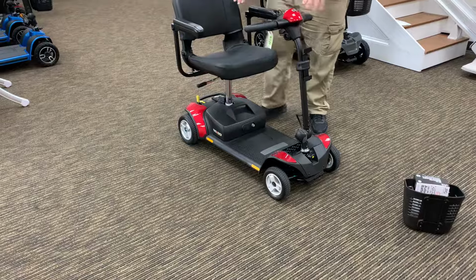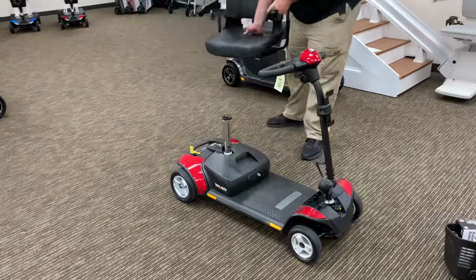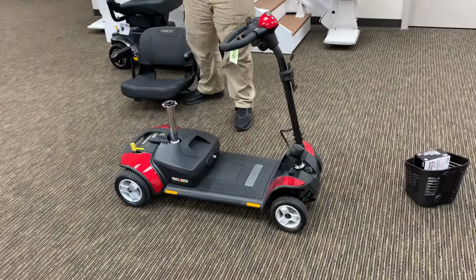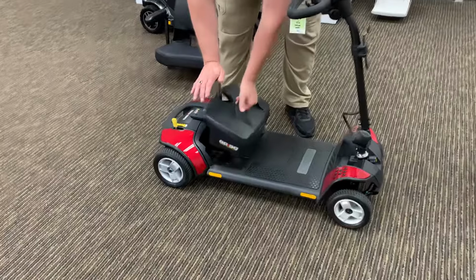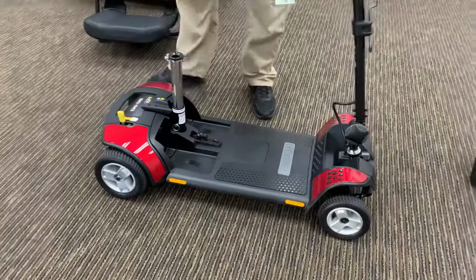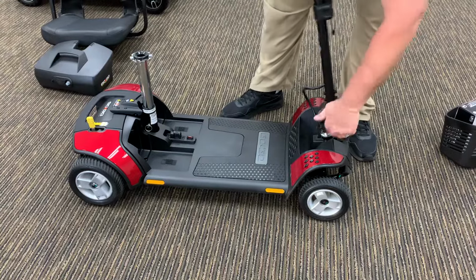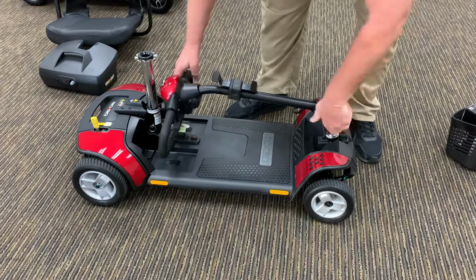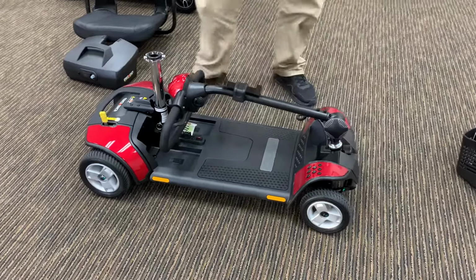And then also, the seat comes right off. You pull straight up. If you're having trouble getting the seat off, then you're probably not doing it correctly. It just comes straight up, no pressure. Take the battery off. It's Velcroed in, so give it a good tug. Comes right up. You want to lower this. Tighten that back down. And now you want to separate the body part.